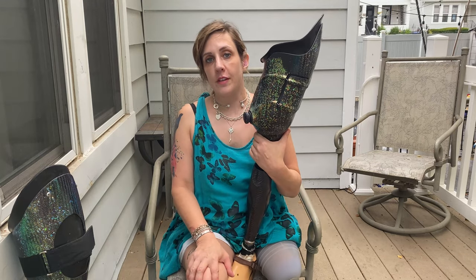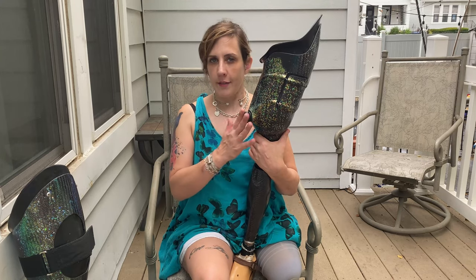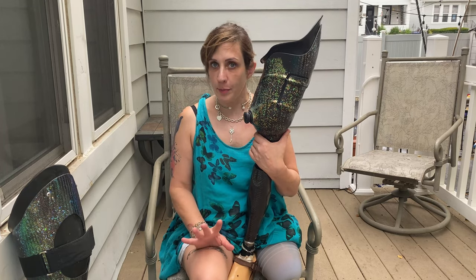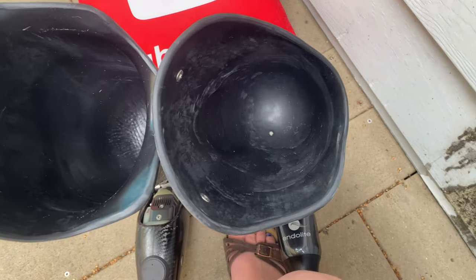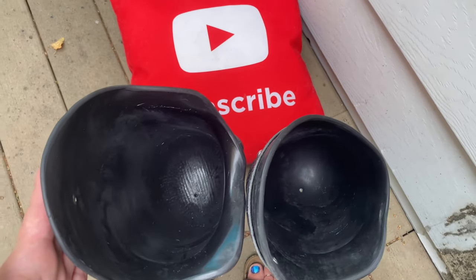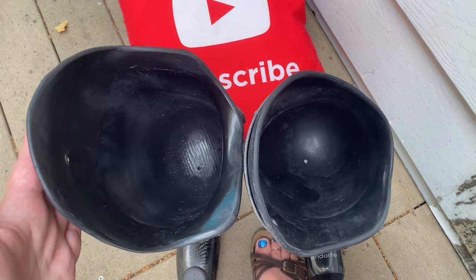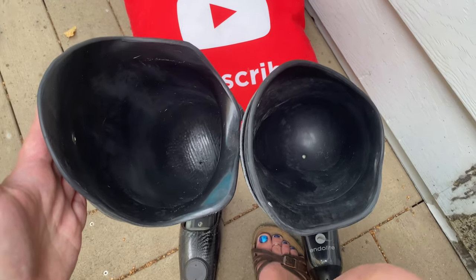I also want to show you the difference in shape of these two sockets — this isn't necessarily related to having a BOA socket. It's just that my prosthetist decided to try a different type of socket with a different shape, and it is actually way more comfortable than my first socket. You can see that this socket is very round shaped and this socket is more rectangular shaped, and that is a different way of containing the volume of my residual limb tissue.